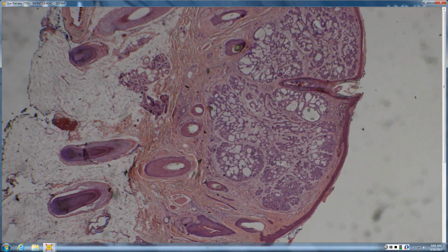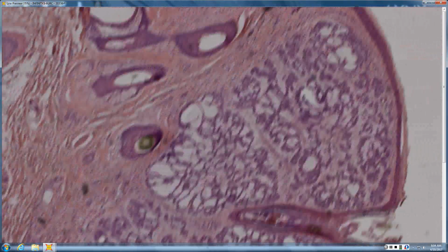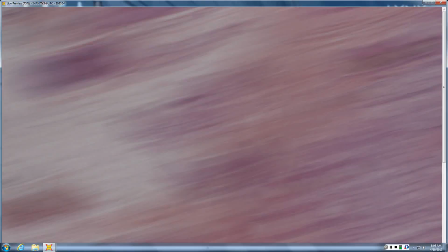Anyway, this is a basaloid neoplasm. So basal cell. From up here, I'd even make sure it's not Merkel. Yep, because they're a little smudgy. The nuclei are a little smudgy. The adenoid appearance goes more with basal. Agree. But when the time to get immunostains is when you wonder if you should have, so getting Merkel markers would not be wrong.